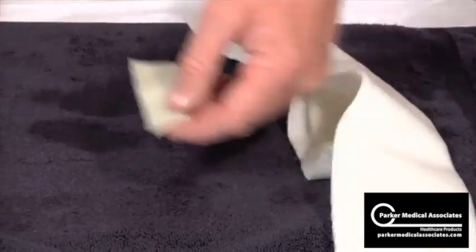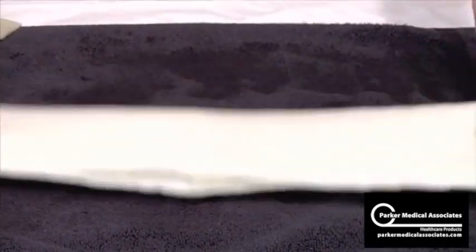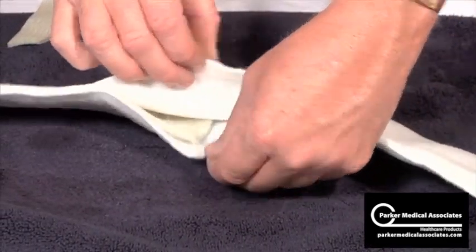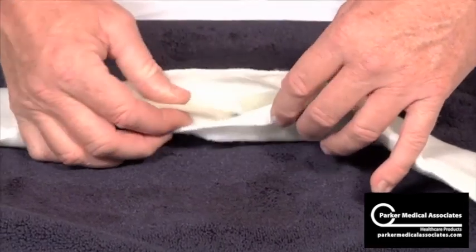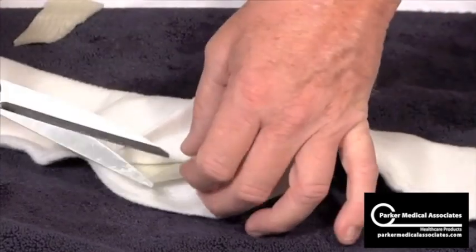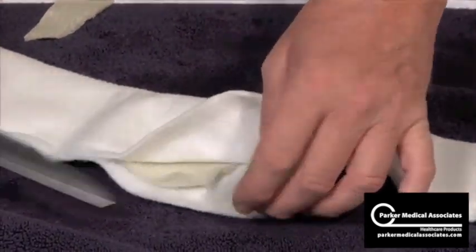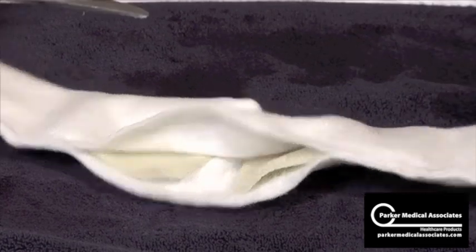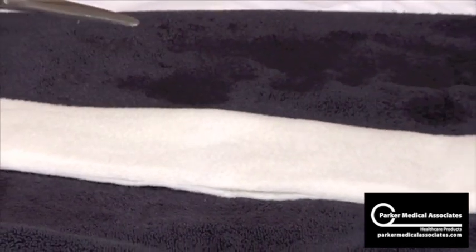Just take that piece right out. Something you might want to do — I like to show this — on these corners here, just sort of cut those corners away so they're not so sharp. Just cut those corners away. Then grab both ends at the same time and stretch.